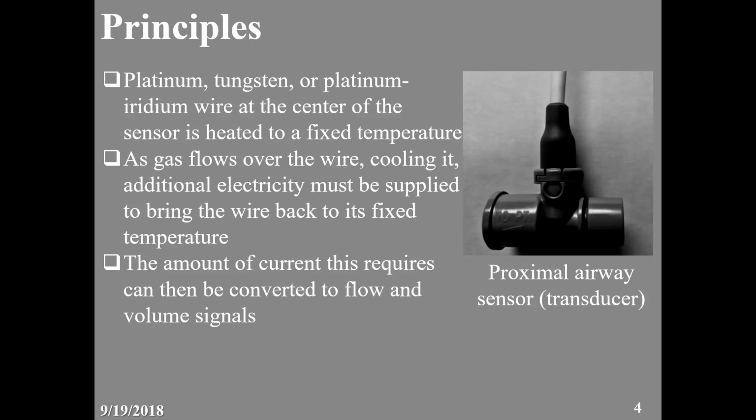And as we said, when we receive the signal, the flow sensor will start measuring and also remove the noise. And that's why we always need to calibrate the sensor, as we said, to make the measurement make sense. Any question? It's very important that you understand what I'm telling you. Okay? So if you have a question, please stop me.